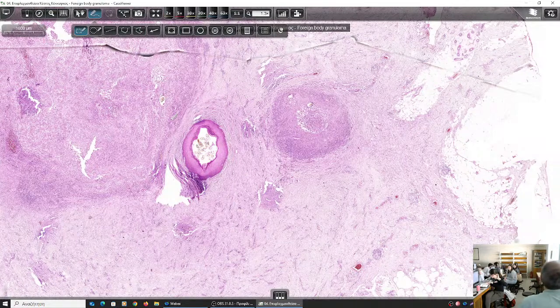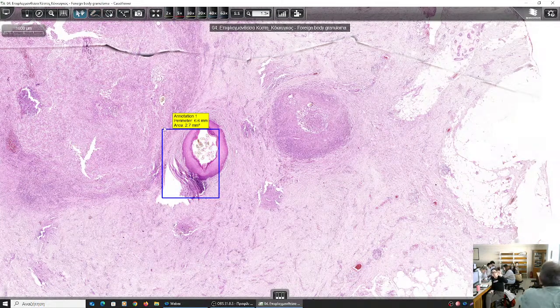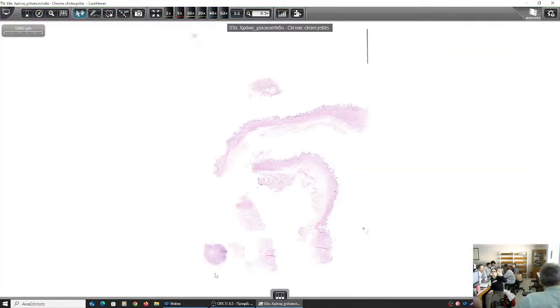No, sorry. The lymphoid follicles are in a lymph node, which may make a lymphoma if it becomes malignant. No, they are normal constituents of a normal lymph node. They are called lymphoid follicles, B cells, in the lymph node cortex.